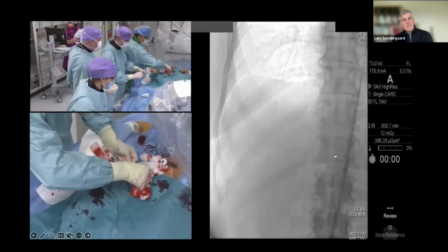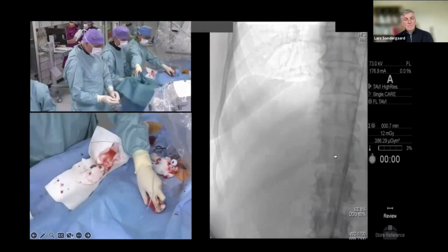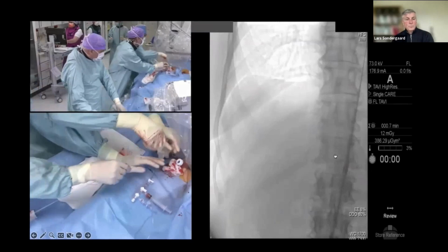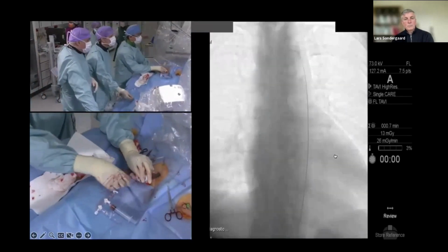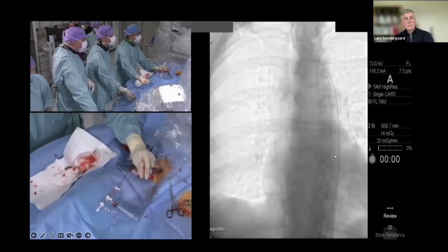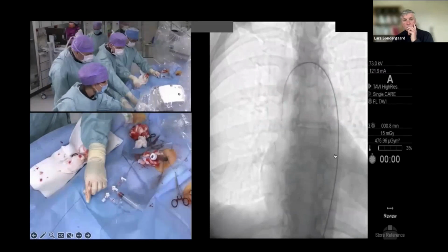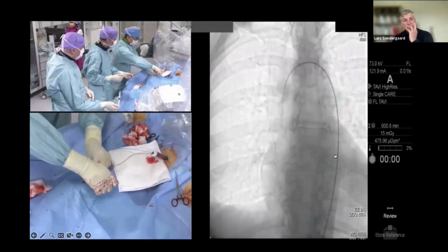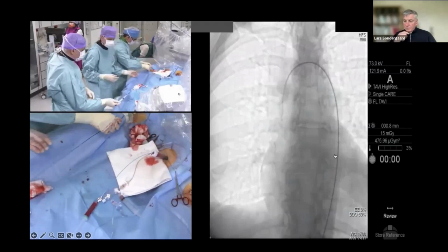We're going to avoid doing this aortic root injection to identify the neck vessels. We know the anatomy from the pre-procedural CT scan, and this AL1 catheter is going to sit in the outer curve of the aortic arch as a landmark. So having the CT scan and this catheter means that we again can do this step of the procedure without any contrast. We've got a 6 French sheath now in the right radial artery, and this is just a BMW wire, a coronary wire.